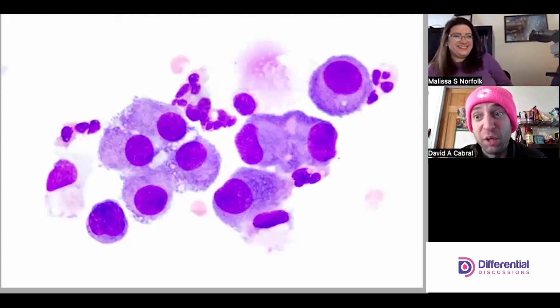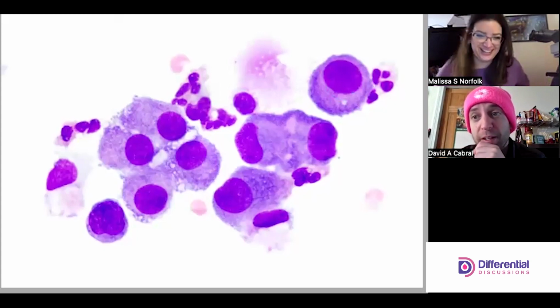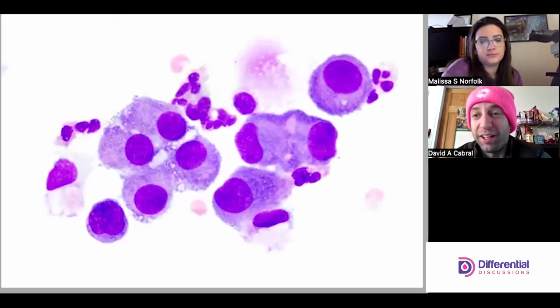And they can have really wacky cytoplasms too, right? Yes. I think that's a different bag of worms. Yeah, it is. But yeah, the size of the nucleus, the chromatin pattern, honestly, the nucleus is just completely inconsistent with a plasma cell. It's tough to put into words, but it's just reflexive to me. And I'll see this on occasion.